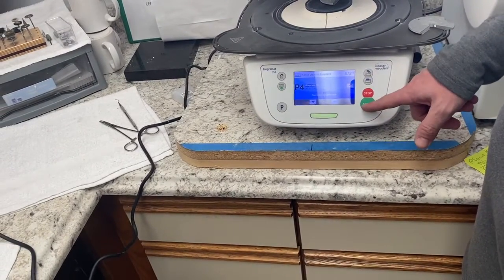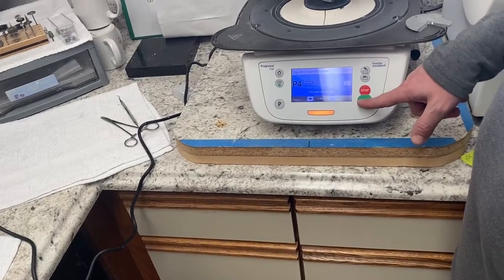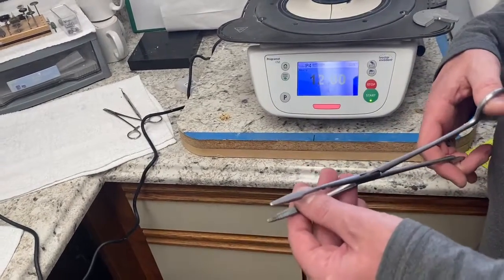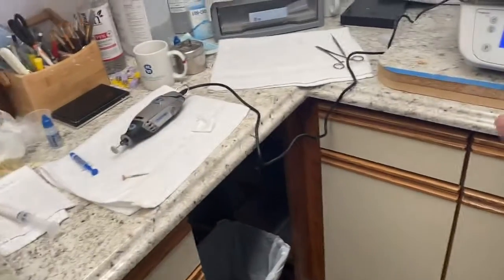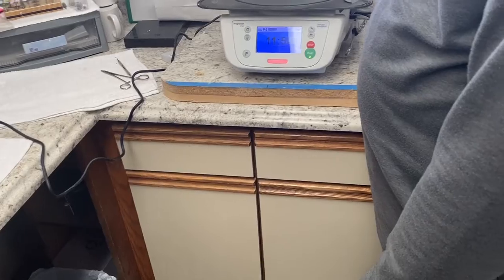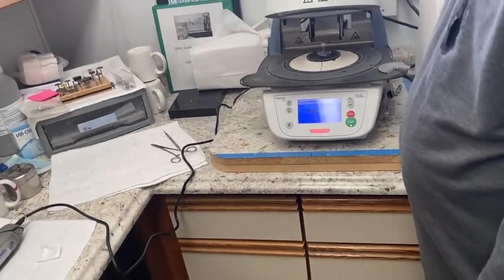All you have to do is hit start. If you hit close and walk away, you will burn your crown big time. So all you have to do is hit start. It's going to start closing the lid, and it does what's called a pre-drying phase for just a couple minutes at the beginning. If there's water in there, that water will expand, turn to steam, so at 1700 degrees, it'll explode the crown. So it's trying to dry any water out right now at a lower temperature. And you realize what happens at 1700 degrees, a lot of bad things.